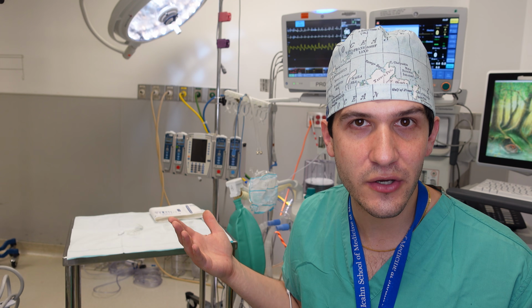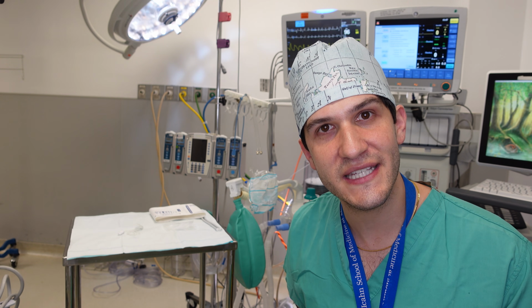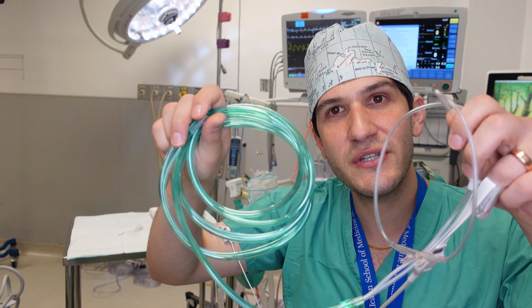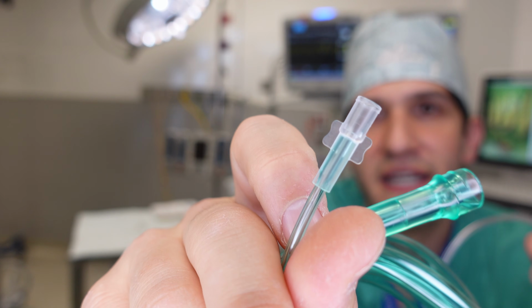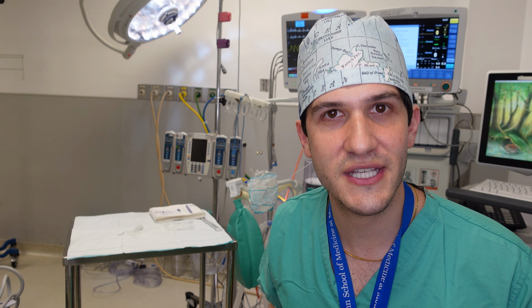But because for this video, I didn't particularly feel like intubating myself, I'm going to use a non-invasive capnography device, which is essentially this special nasal cannula, which has, in addition to an oxygen port here, a connection that specifically measures capnography and hooks up to the machine just like this.